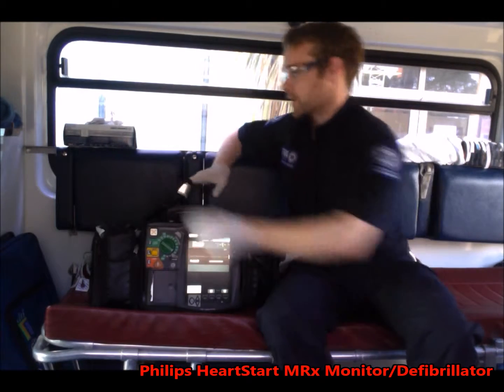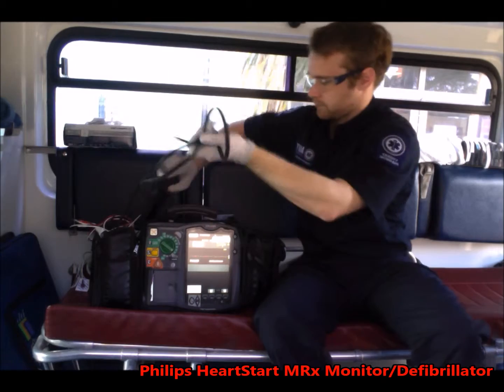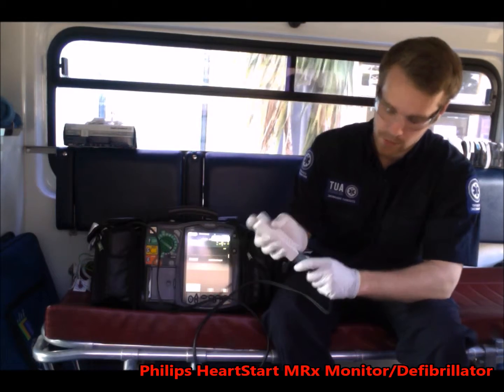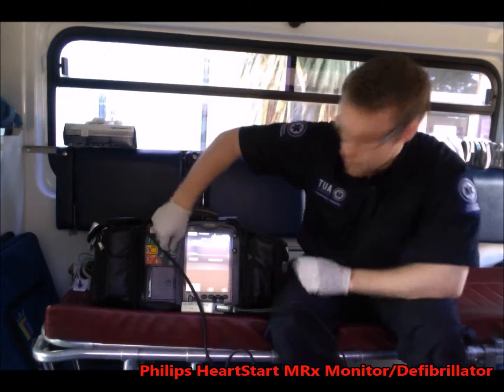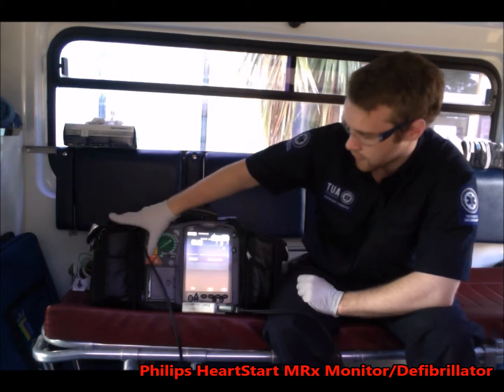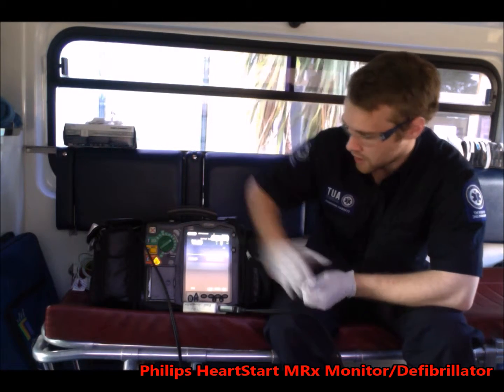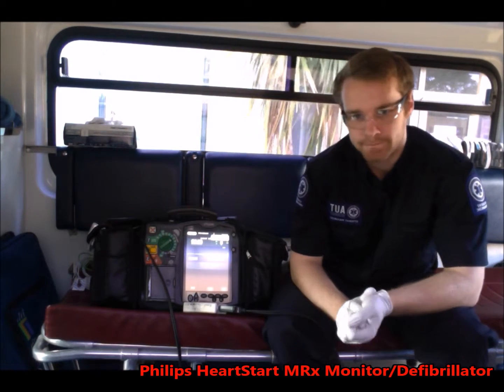So next we want to get our defib cord and attach a test load to it. Just by plugging that into this cord here. Next we want to set the charge at 50 joules. Next we want to click charge. So that's charged. And to fire off the charge, or to shock, we press the shock button. And then the shock is administered.